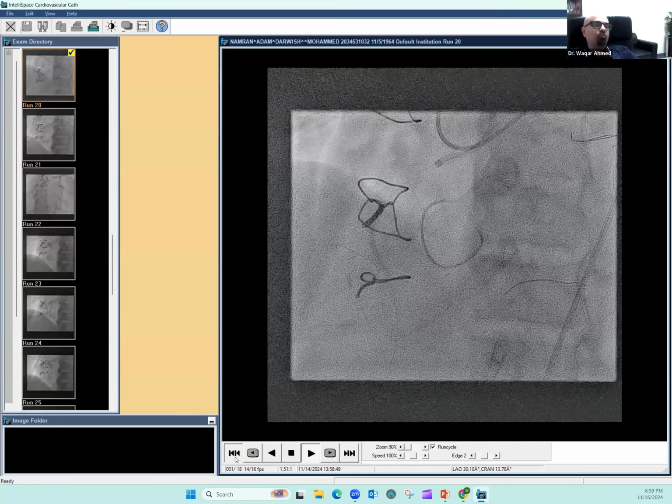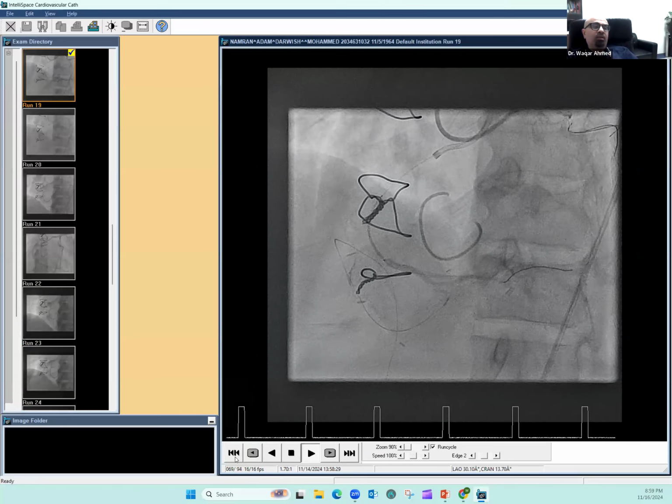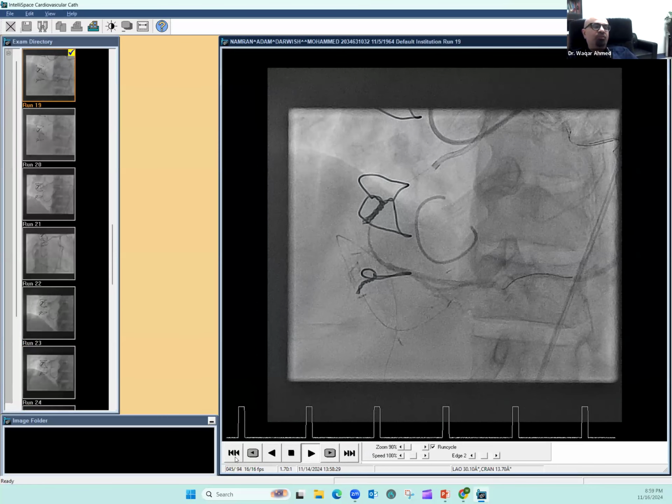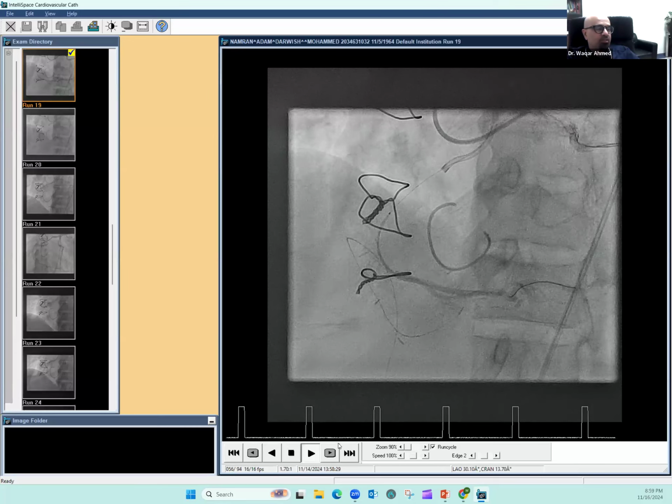So here's the first Nagomi stent. This is a 2.5 by 38 Nagomi. By intravascular ultrasound, this vessel was about 3.0, but I took a 2.5. I've become conservative. I've had perforations by going EEM and sizing. So I go one size less.